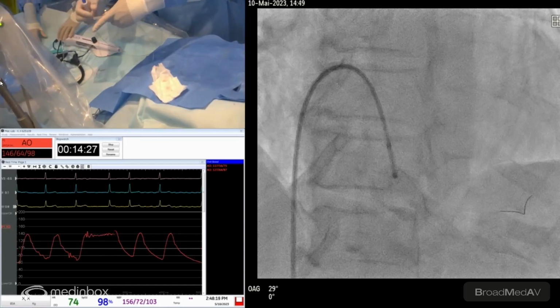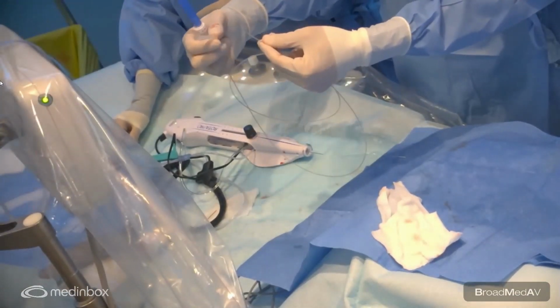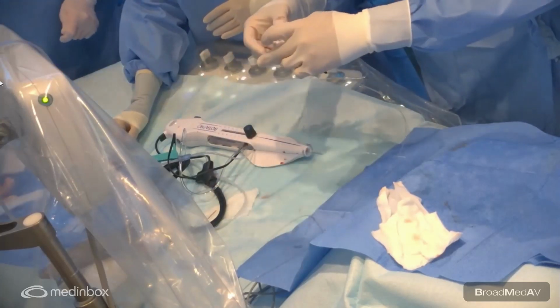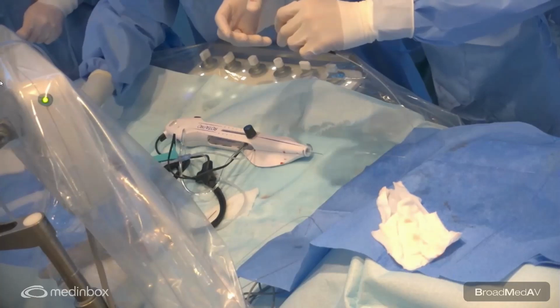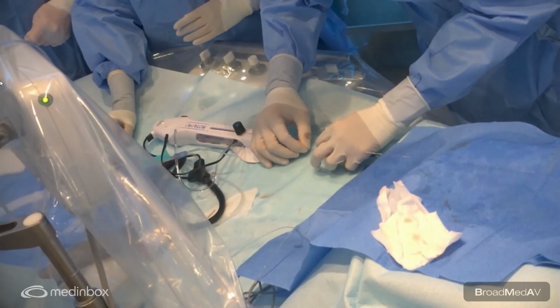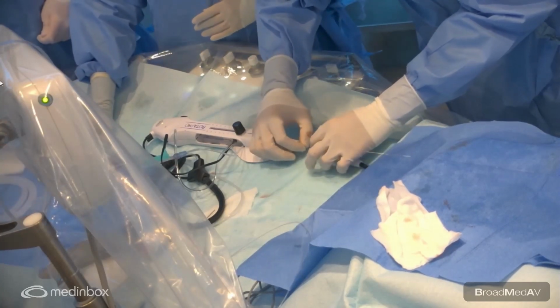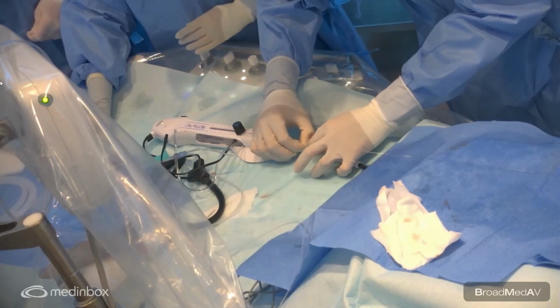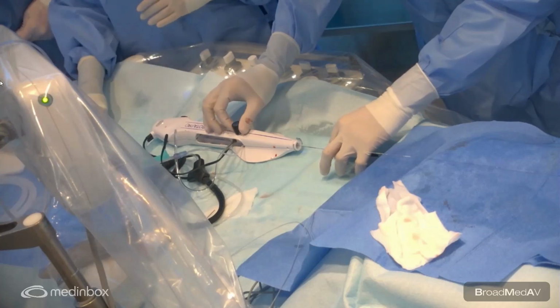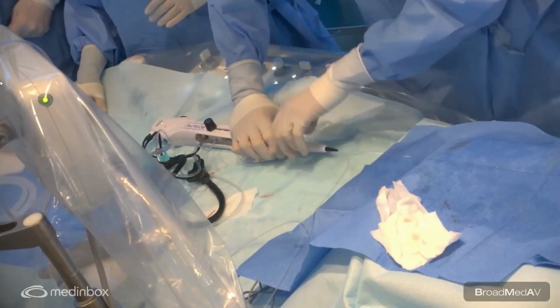So first thing you do with the 175, you take off this plastic cover. And then the blue one. So then you hold it just in front of the yellow sleeve. And there's like two teeth that need to be facing each other. You slip it on, and then you slip on the yellow sleeve, and then you pull, make sure it's well attached. It's fine. Then you hold the plastic end, unlock it, and then you advance everything so you don't kink anything in. Then make sure you get a click.